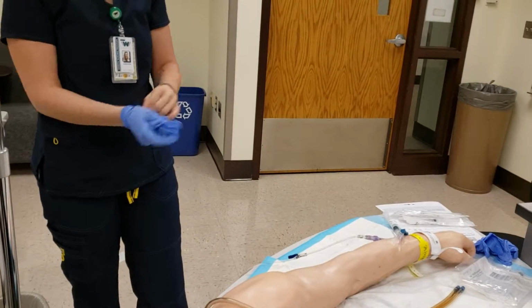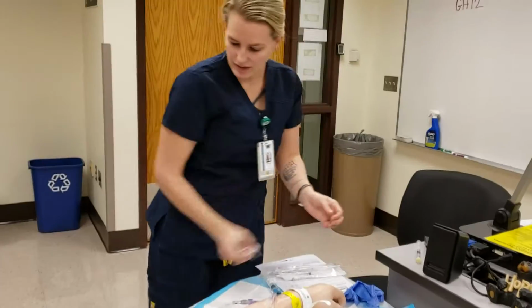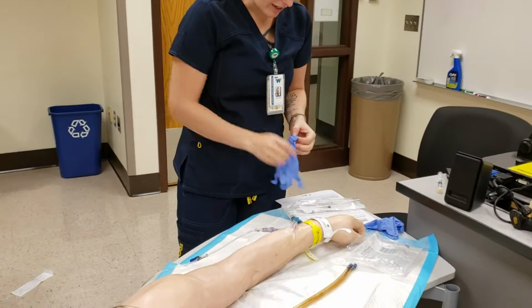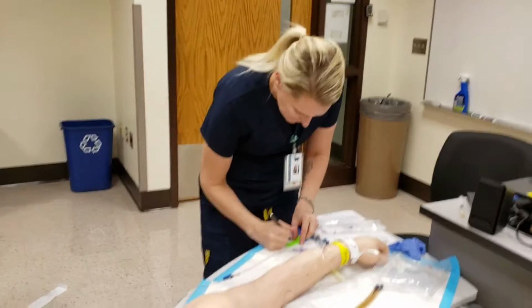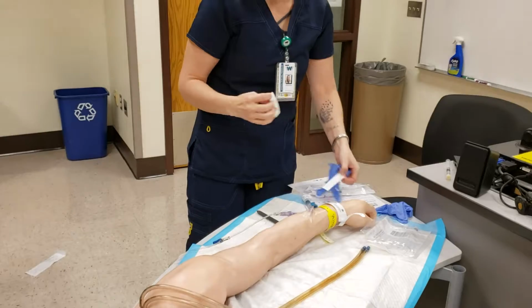Great. Oh, we have your morphine to give. Sorry about that. So I would wash my hands. All right, Shirley, so I have your morphine here that we're gonna give. Oh, I would label my tubing. And then I would write my IV start time.